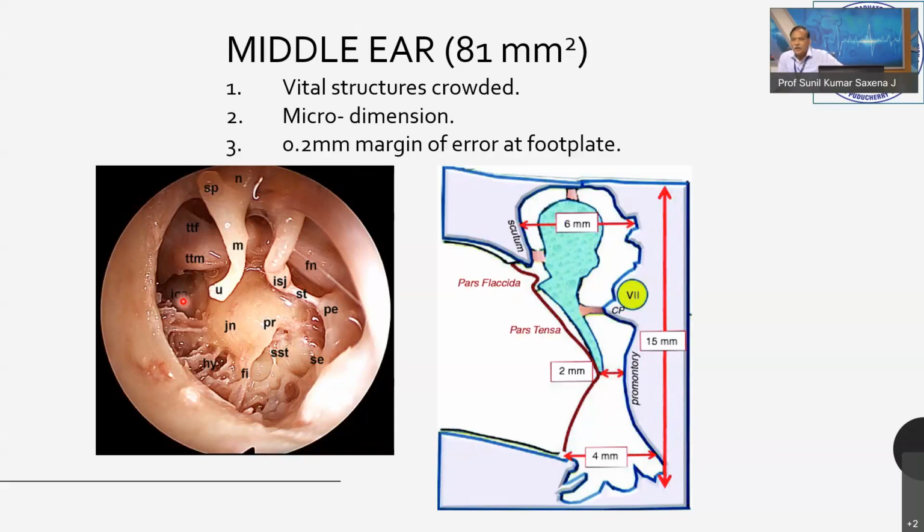can see the pulsation. Yes, you can use the 2.7 mm, but remember one thing, if you use the 2.7 mm endoscope, your vision will not be that wide. Second thing, when your endoscope is smaller, the chances of injury are more. You will go and hit the bony meatus, much more common than with the 4 millimeter. But if needed, a 3 mm endoscope can be used. To begin with, you will start with 4 mm, and once you have a little narrow canal, you switch over to 3 mm. 2.7 is a little lesser.